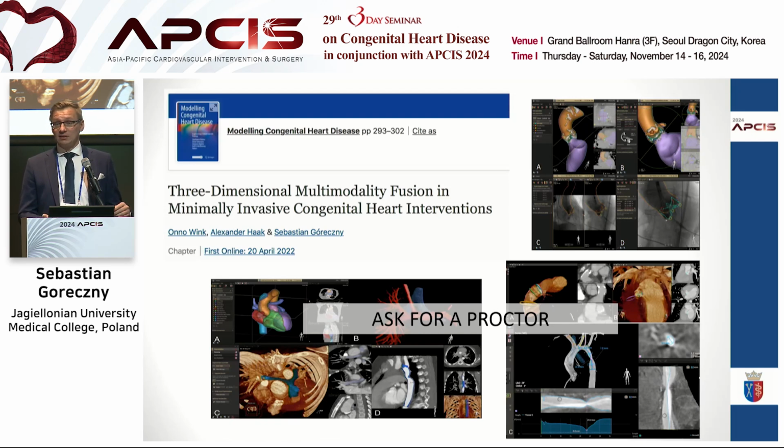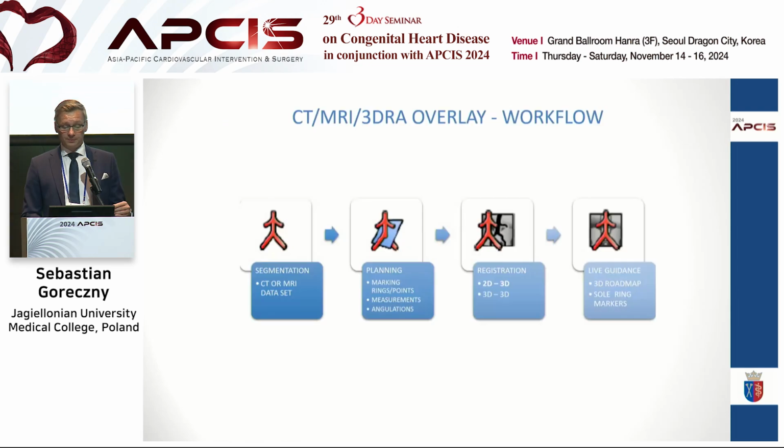And proctoring is the way that people acquire new techniques and bring them into their labs. However, for imaging, 3D imaging is not that popular, but it depends on you. If you ask your vendor, they should provide you people with experience in that software.